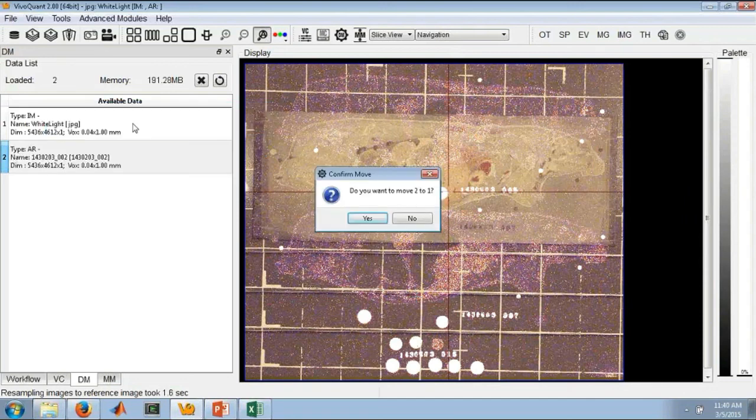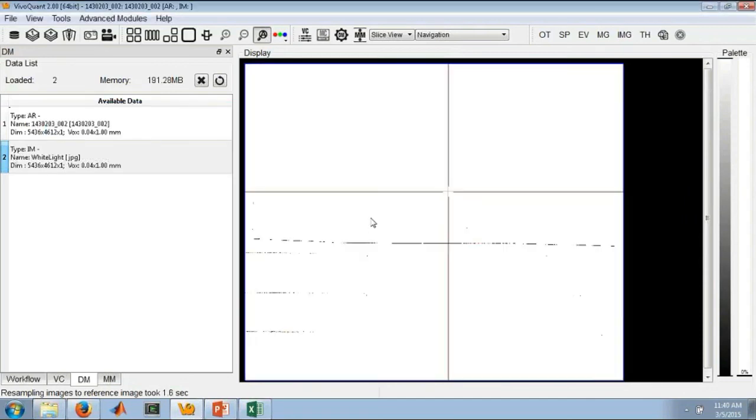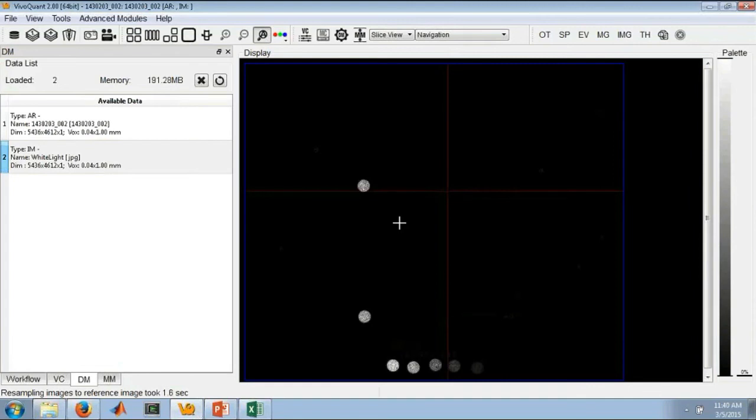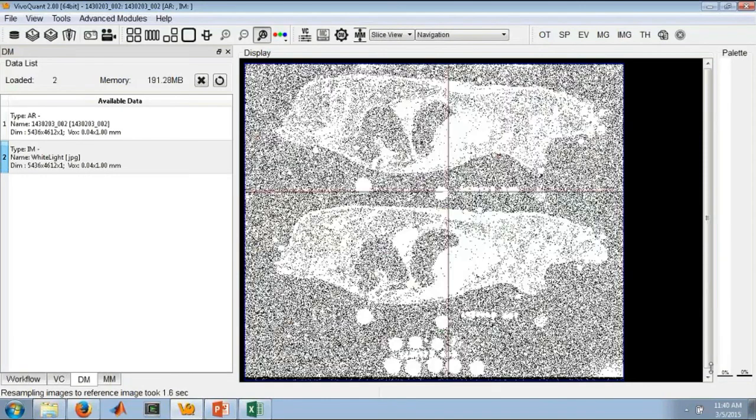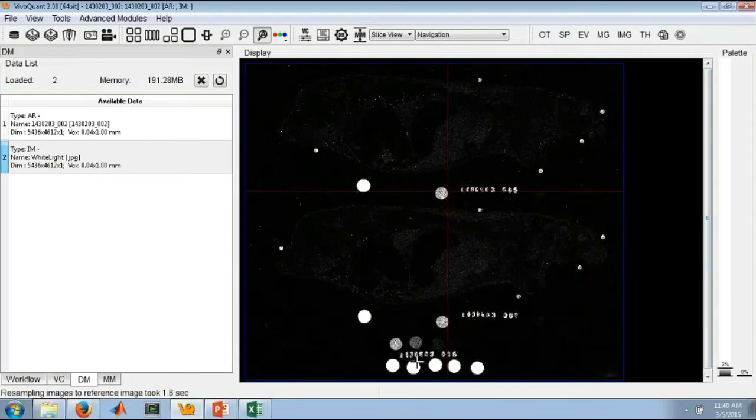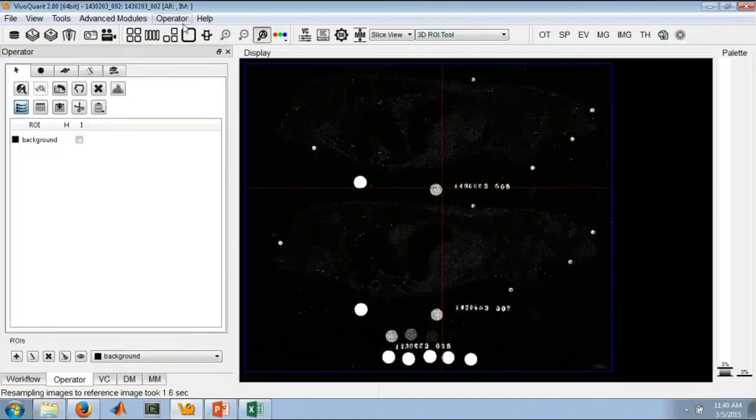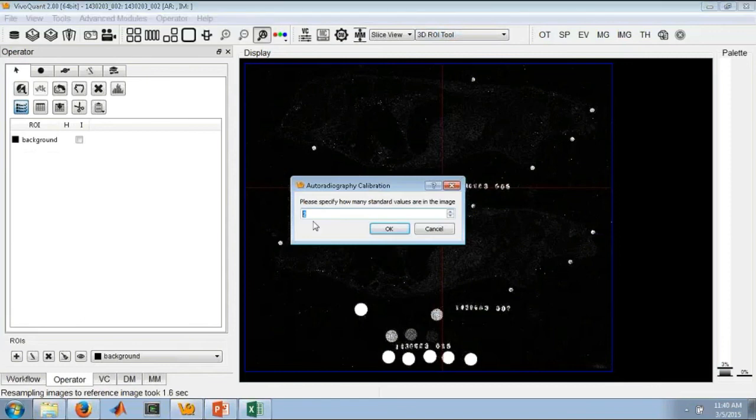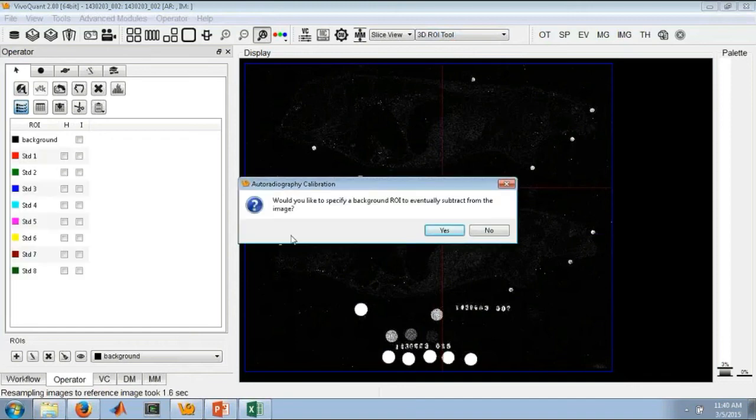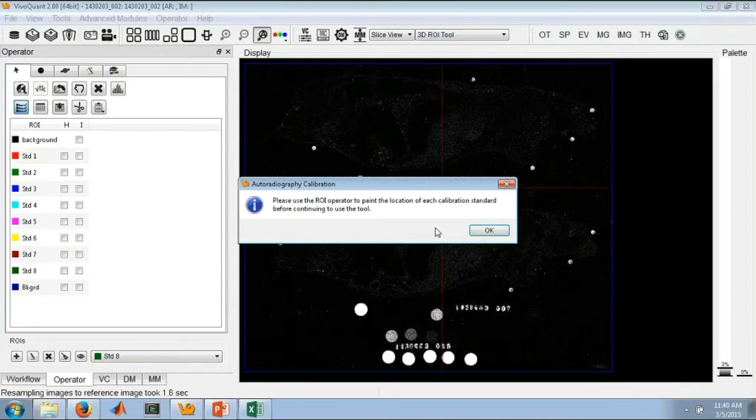We'll quickly make the autorad data the reference. Now you can see it here. We have our calibration standards at the bottom. If we go into the 3D ROI tool, we've added in this operator menu an autoradiography calibration option. This tool, brand new. First thing it will do is ask me how many calibration standards I wish to use. In this case, I'll just say eight. And then if I also want to use a background ROI, I'll say yes. Now here we just use our pre-existing 3D ROI tool to place the regions on the standards.